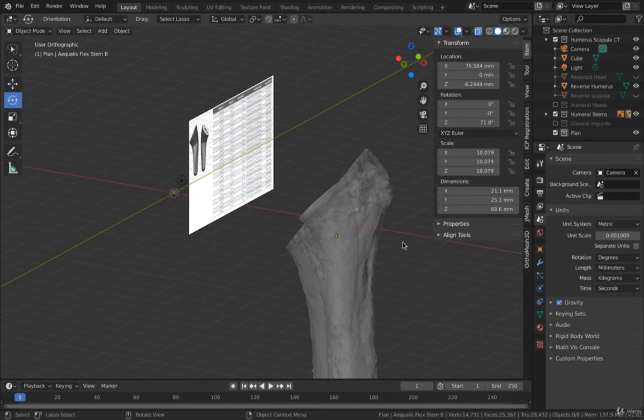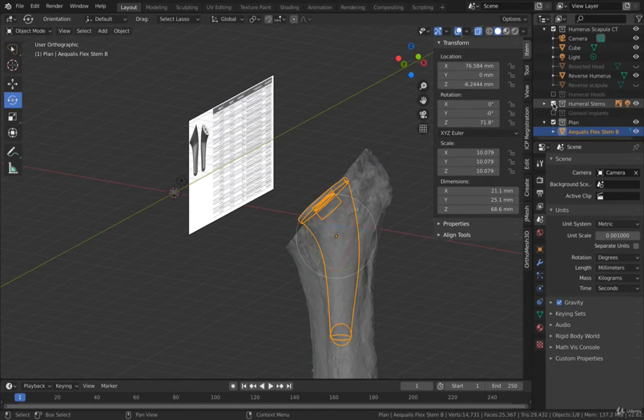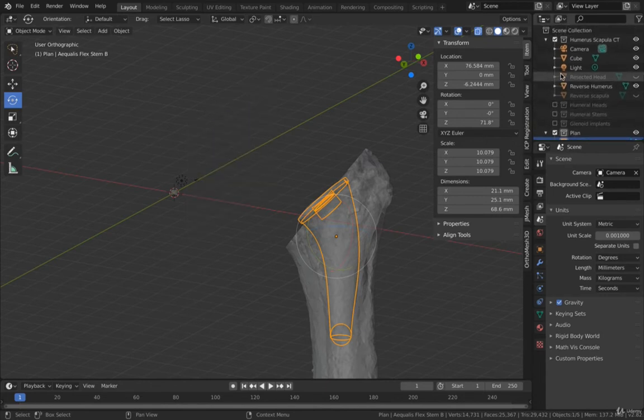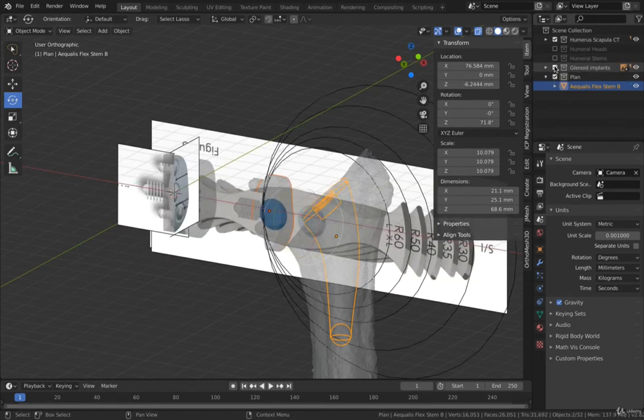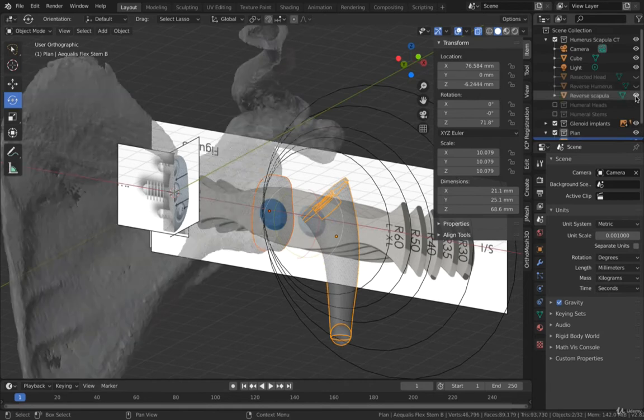Now that we have finished the stem, we can just move the selected stem down to the plan. So I'm going to click on the stem and slide it to the plan. And then I can just make the humeral stems invisible, so we have things organized. Now I'm going to go to the glenoid implants and bring them in place. I don't need to see the humerus now, so we're going to make that invisible and bring the scapula in.